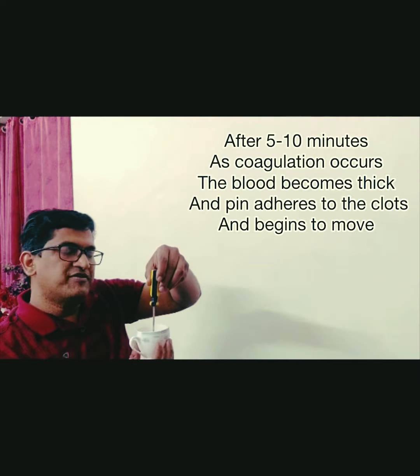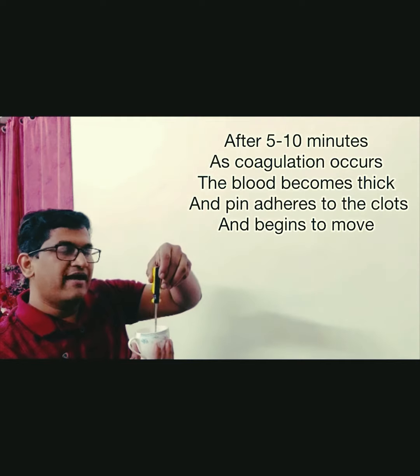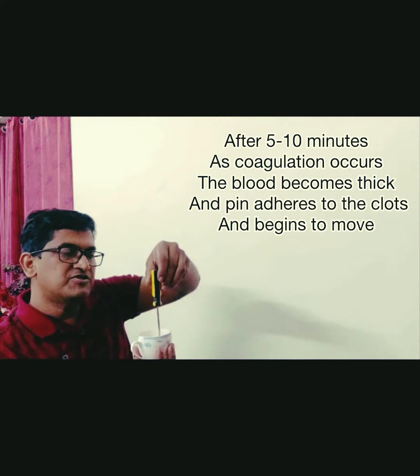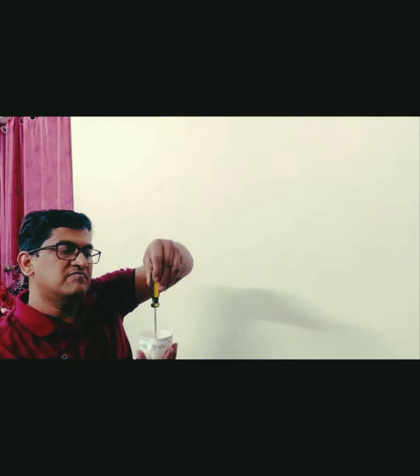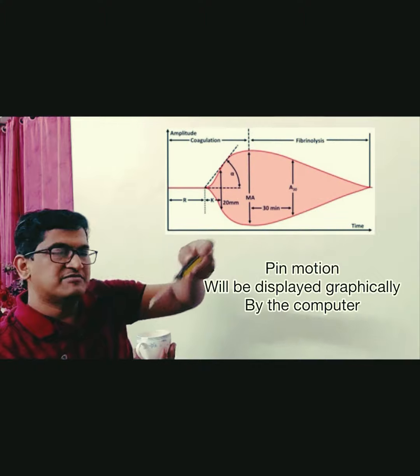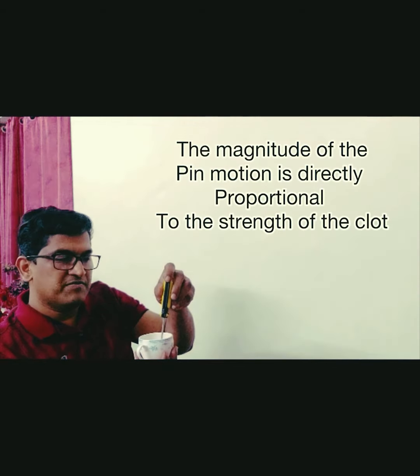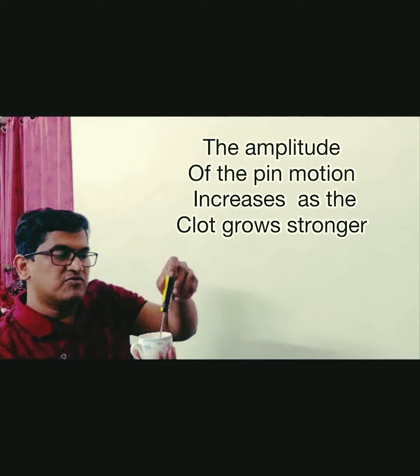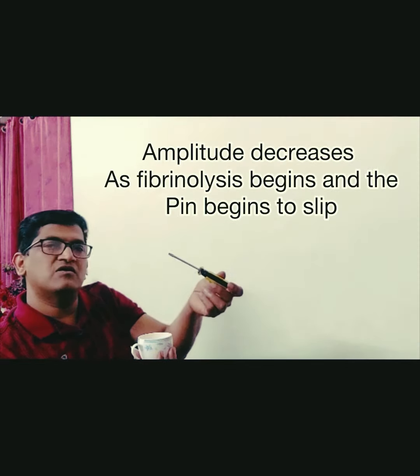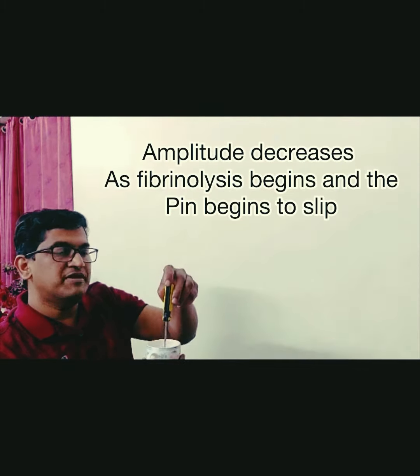See, now the pin is not moving, only the cup is moving. After 5 to 10 minutes, as coagulation occurs, the blood becomes thick and the pin adheres to the clot and begins to move with it. So now we can see both are moving. That means coagulation starts. The pin motion will be displayed graphically by the computer. The magnitude of the pin motion is directly proportional to the strength of the clot. The amplitude of the pin motion increases as a clot grows stronger, and amplitude decreases as fibrinolysis begins and the pin begins to slip.